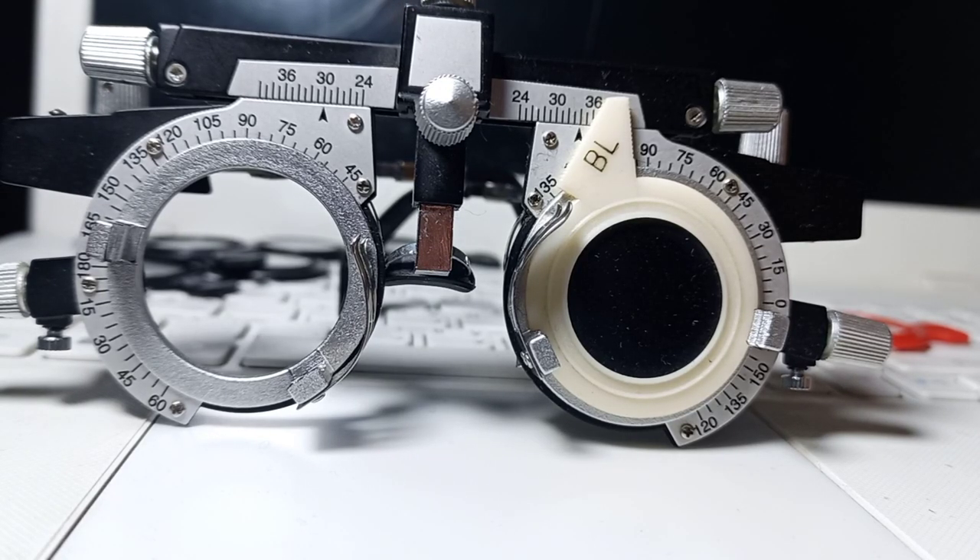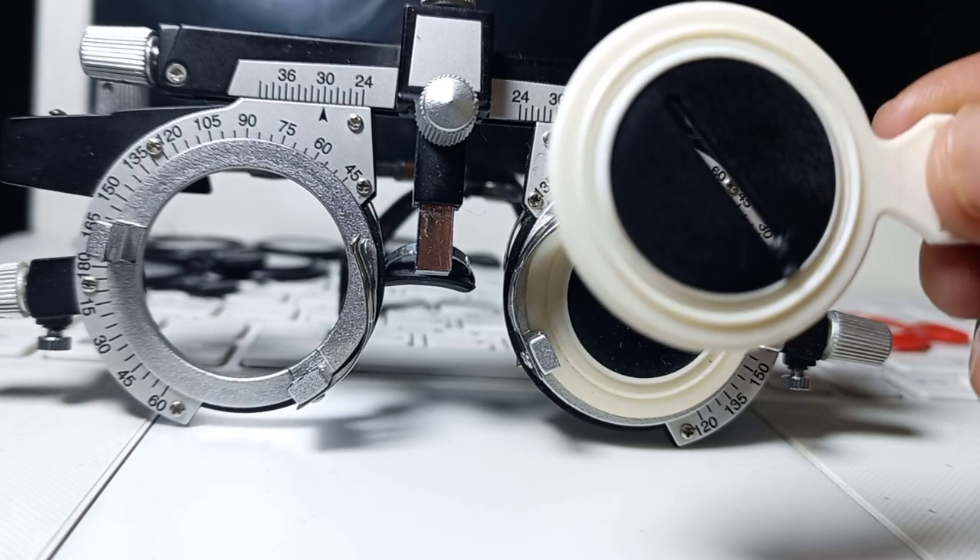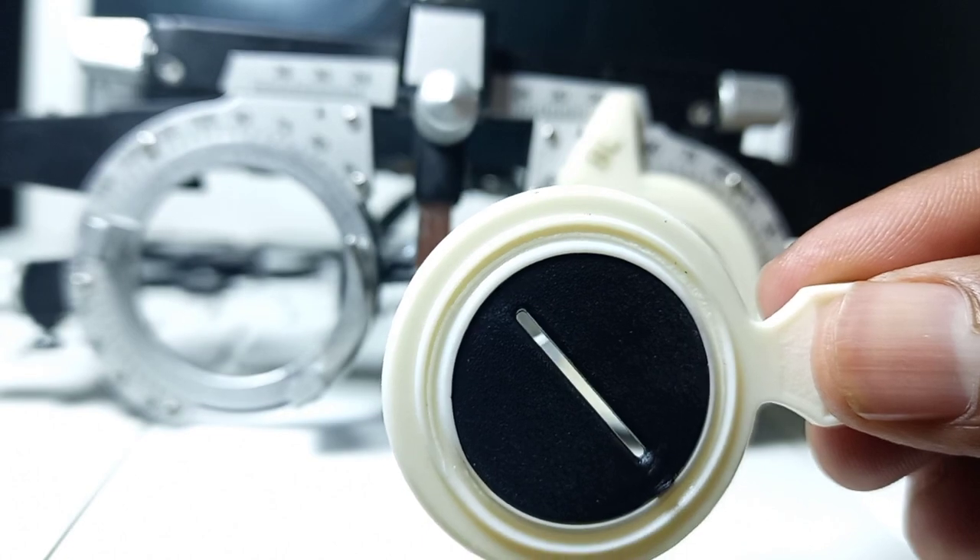Hello my optometry family. Today our topic is how we can treat or manage astigmatism with this stenopic slit.